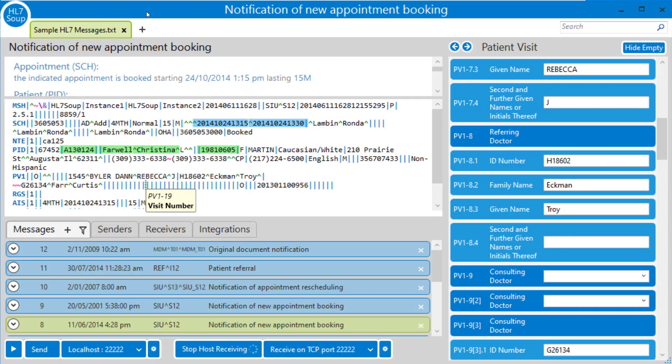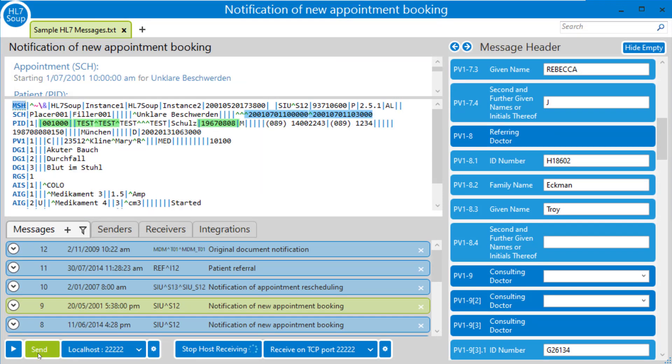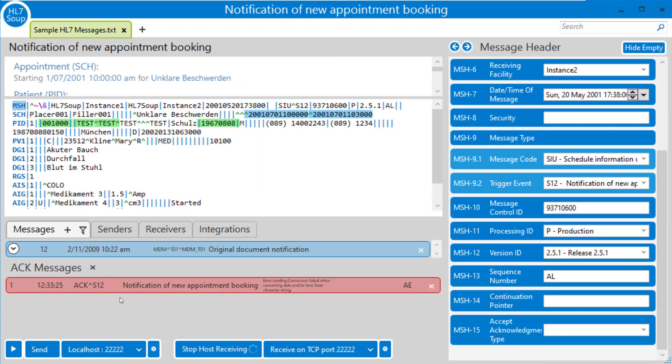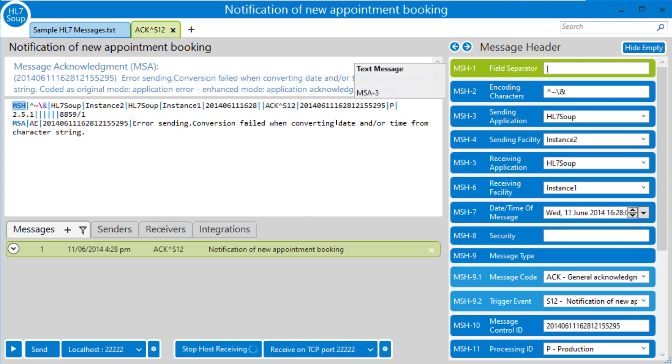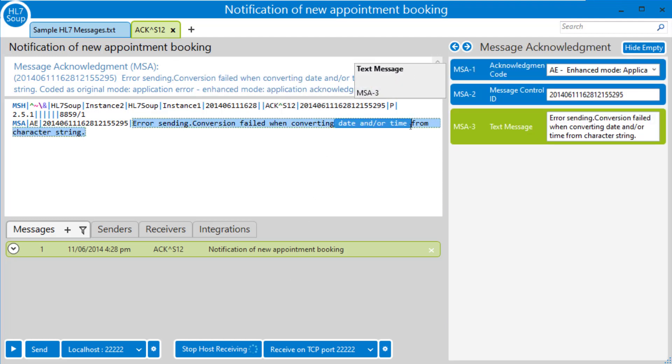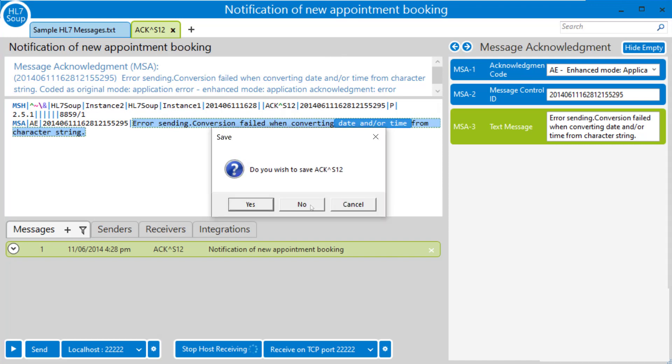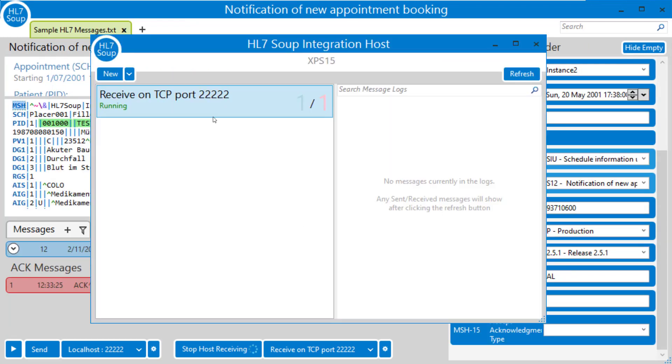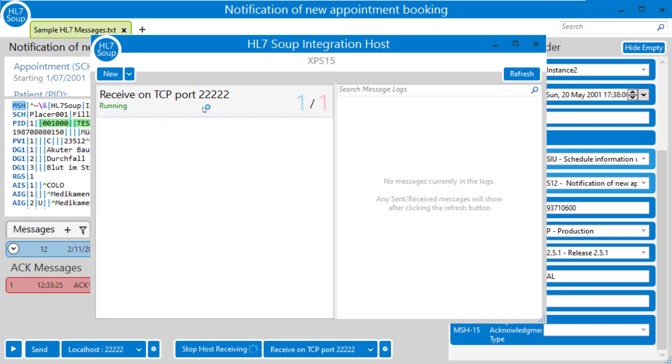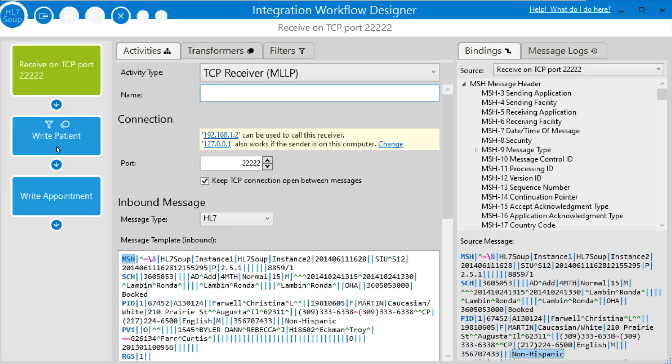And then back to HL7 soup. And I'm going to hit send. And we've got an error coming through. So just double click on it to take a look. I could look in the logs as well. But you can see there's a problem setting the date and time. So I know what that's going to be. Close this. And head back to integration host. Edit the workflow.